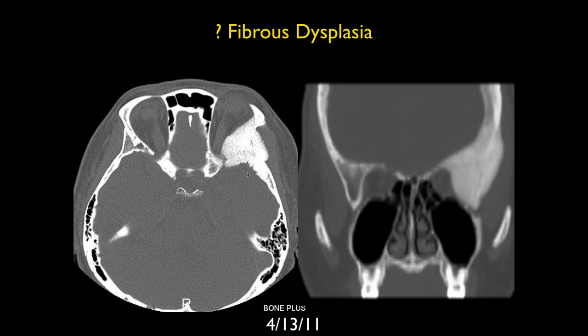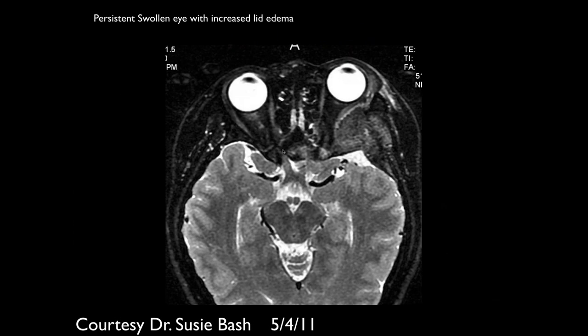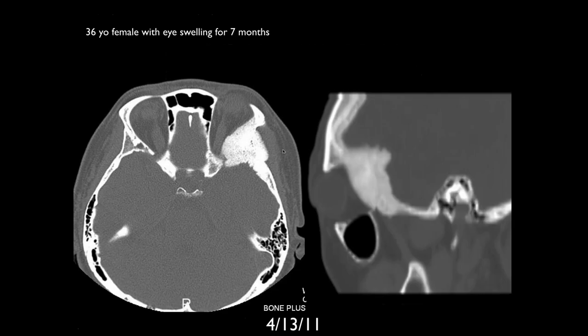Well, why do you ask whether MRI was appropriate or not? I know the CT is not diagnostic, but isn't it as close to diagnostic? I'd love to see the post-op. Well, with the CT, the people thought this was fibrous dysplasia. This is a common location for fibrous dysplasia. Why was MR done? No, but it's progressive, isn't it? Because they weren't sure if it's fibrous dysplasia or not. So they wanted to evaluate the brain and the orbit better. I guess what I'm asking is, if I see this, should I order an MR?